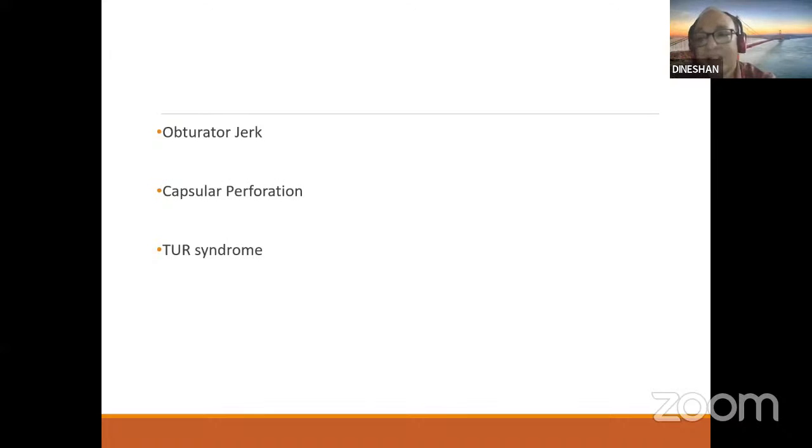The other signs are, one thing is you feel that the prostate is receding from you, because of the extravasation of fluid into the periprostatic tissue, the prostate will get elongated. So the resectoscope will have to move more and more inside towards the bladder neck, so that the tip of the end of the resectoscope outside the meatus will become shorter.